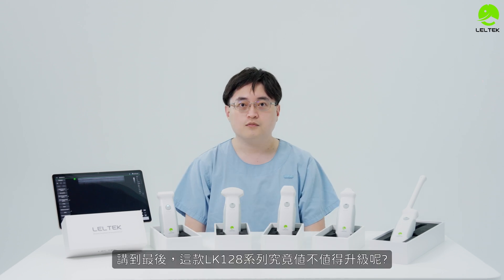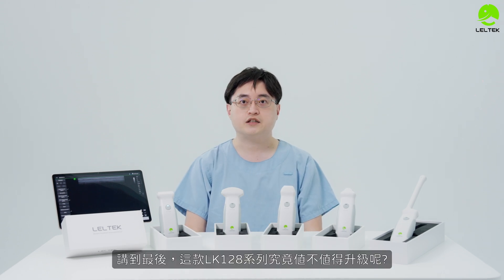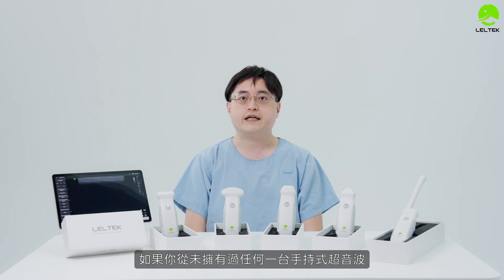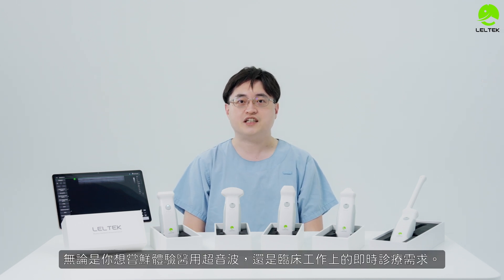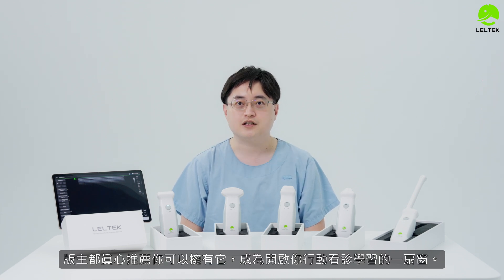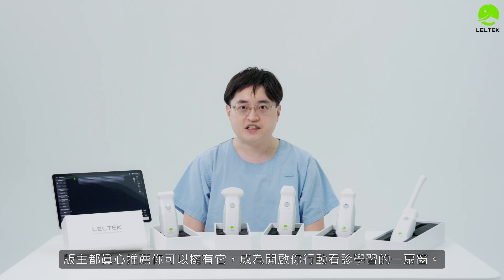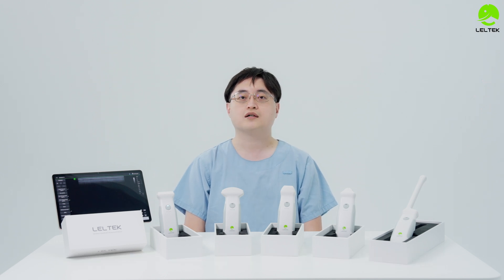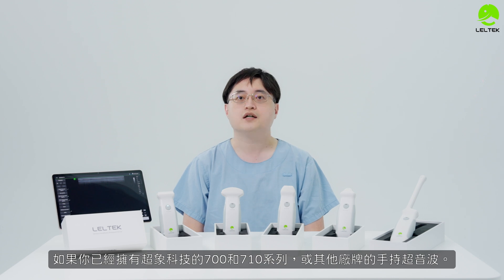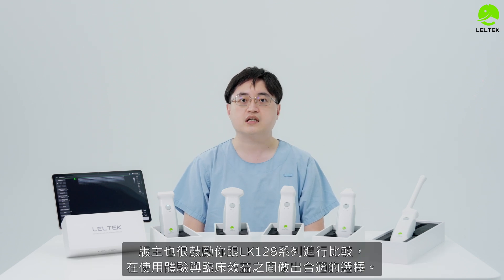Finally, the LK-128 series is worth it. No matter if you are a new user experiencing handheld ultrasound for the first time, or if you already have the 700 or 710 series or other devices, you are encouraged to consider the LK-128 series.